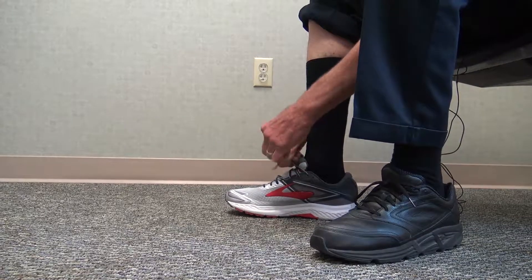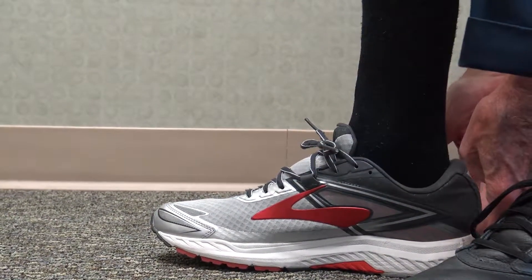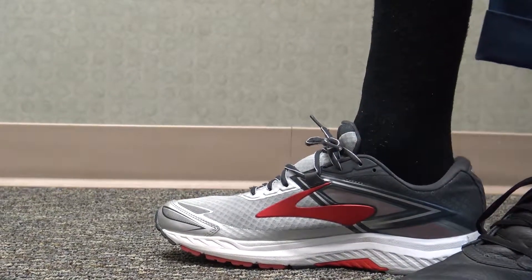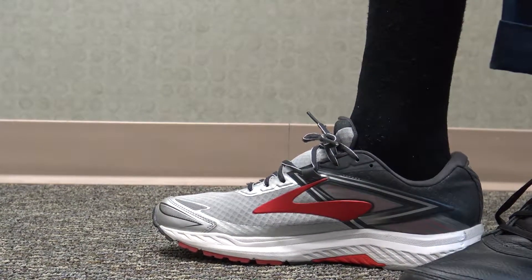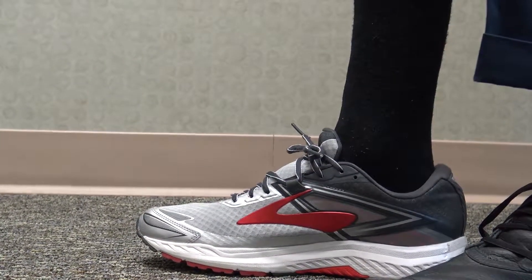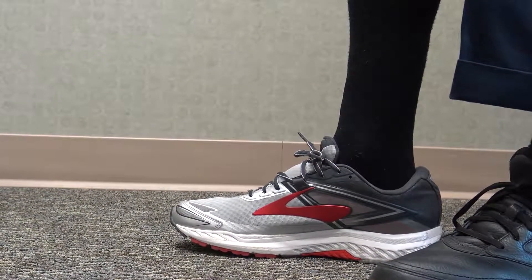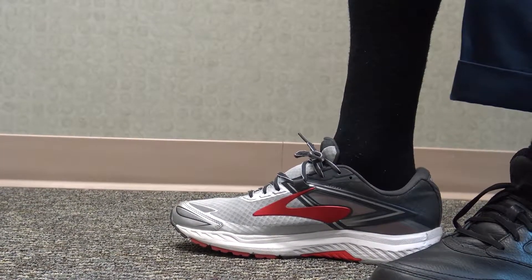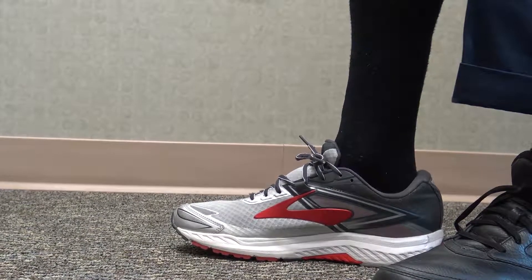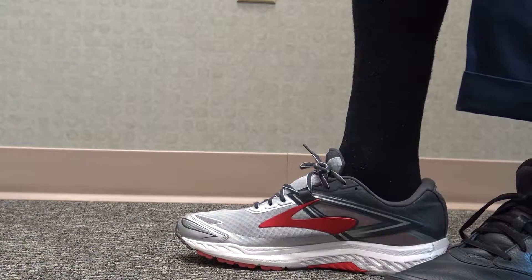There's a progression of steps for fitting. The most important thing is to get the ankle — the posterior strap for the ankle — fit on. Chris Clifford is going to show you the progression of how he puts the brace on. Make sure that they have a good athletic sock; they can't have a thin silk sock.